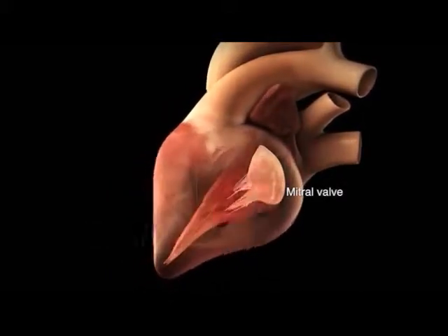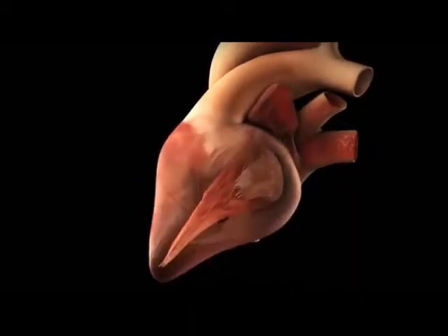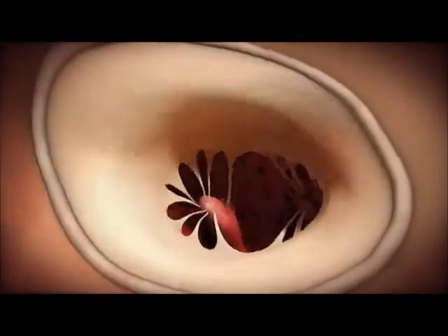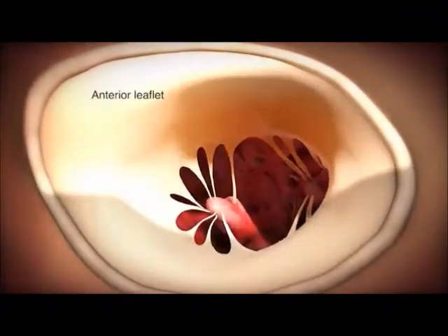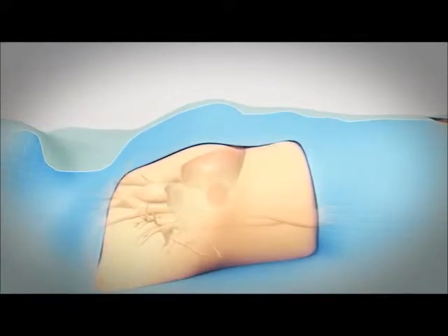The unique hydrodynamics associated with surface adherent jets in the heart, and the qualitative measure of valvular disease severity carried out in Doppler echocardiography, among other features, led to the decision to model and analyze the Coanda effect in vitro to evaluate the influence of an adjacent surface on both regurgitant jet size and Doppler color pixel encoding.